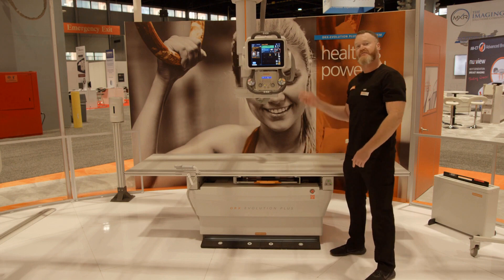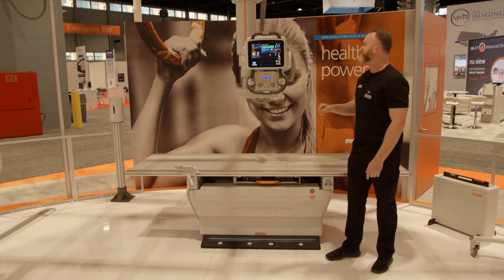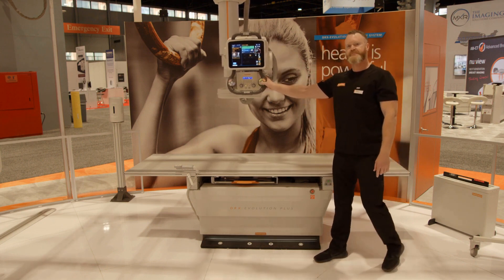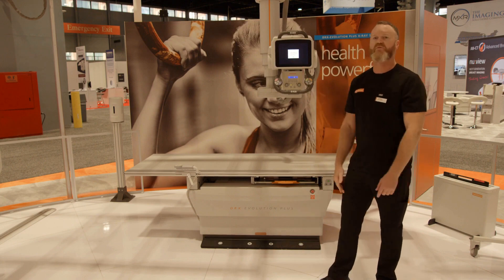Or I can choose to engage the tracking from the tube, and when I do that, now the bucky tray is going to track the tube. That's some of our motorization and automation features. We have more over at the wall stand.